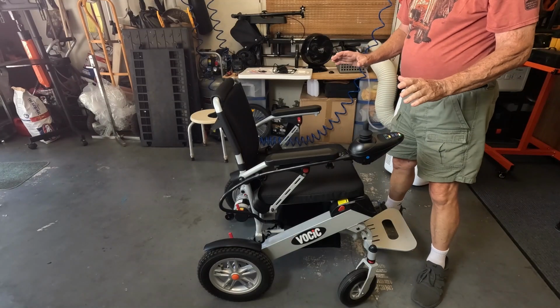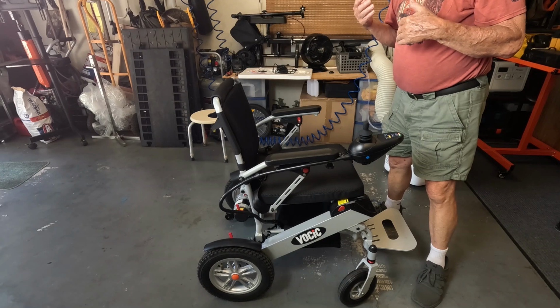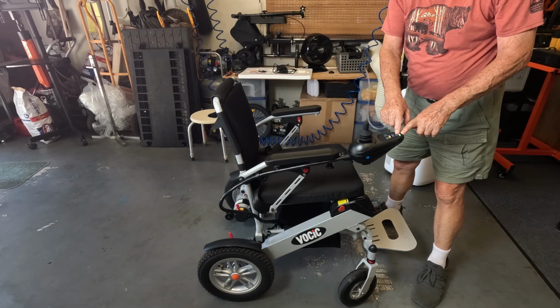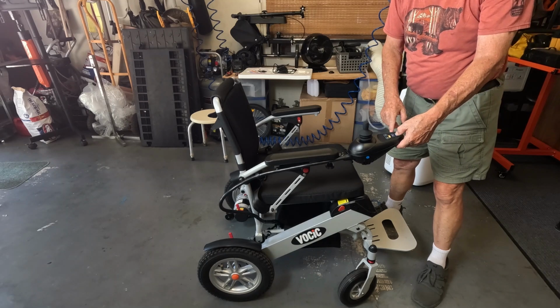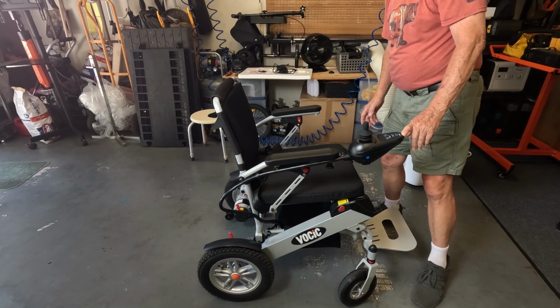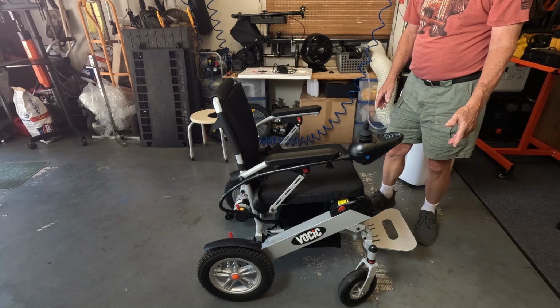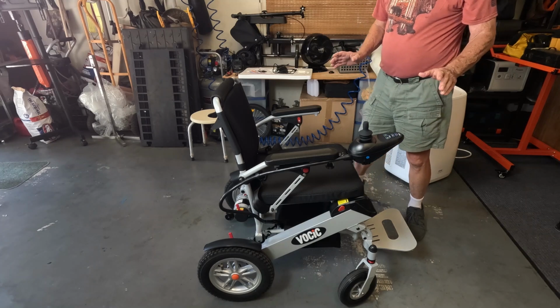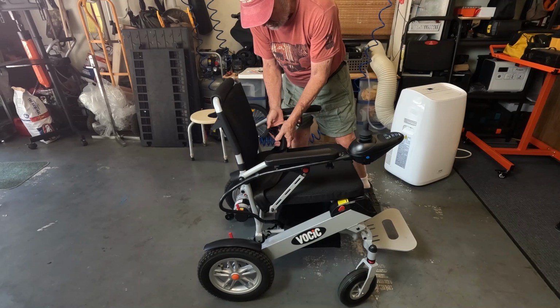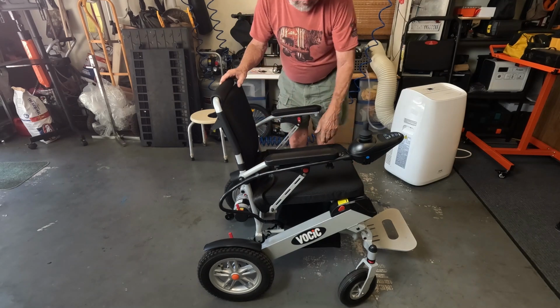Okay, now that we're complete, we're going to go back and fold this up. But first, we've got to turn the power off. And in order to turn the power off, I push and hold this for 3 seconds. That's it. It didn't look like it had to be 3 seconds. It turned off. Okay, now to fold this back up, and I'm going to clip this back together so it doesn't drop out. Seat belt.